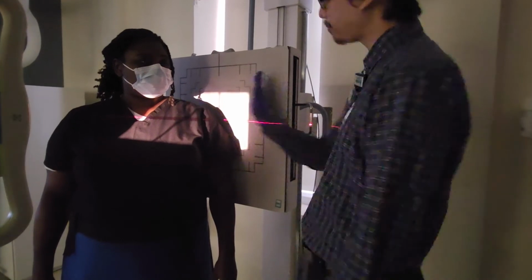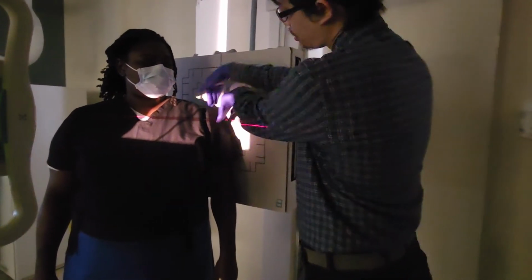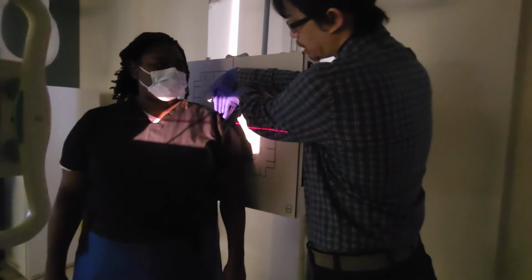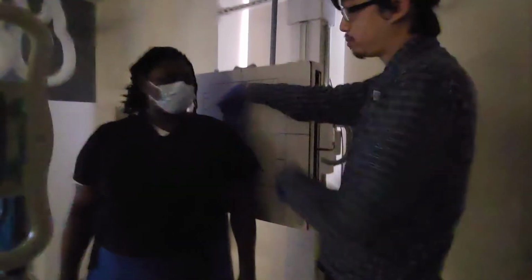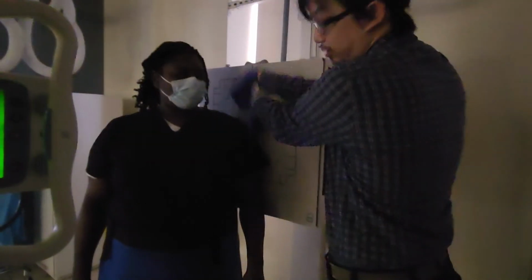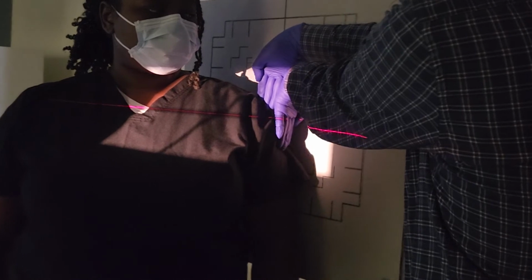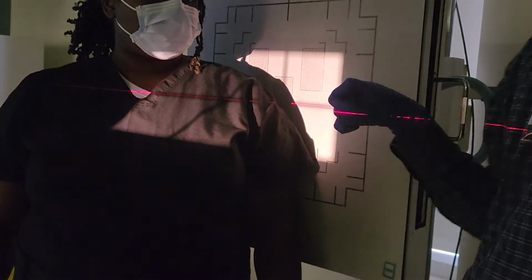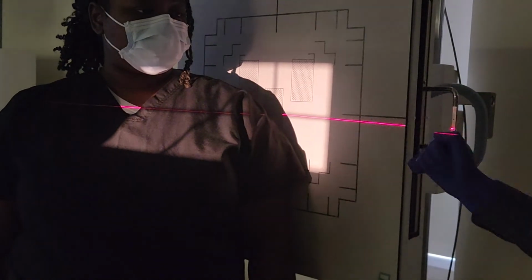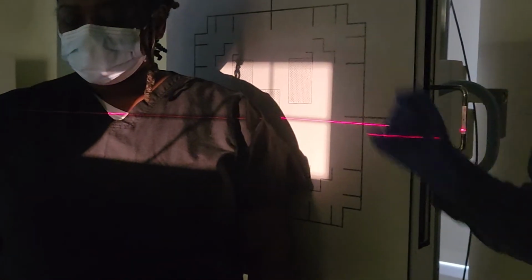We're going to find the side of the shoulder and we're going to go medial 2 inches. Okay, right now we're pretty much there already. Right. Find the side of the patient, side of the shoulder right here, and go medial 2 inches. So I'm just going to push it a tiny bit. There you go. And this is our centering. This is centered to the joint space.